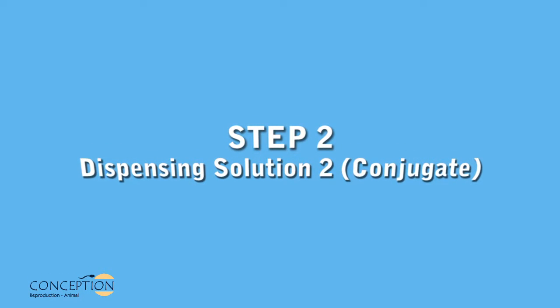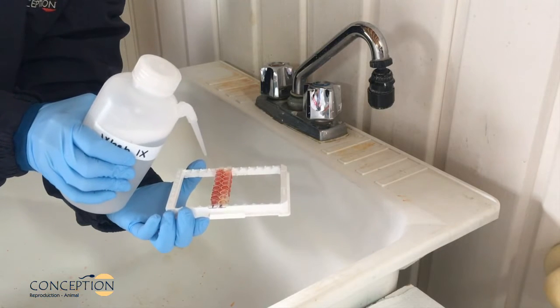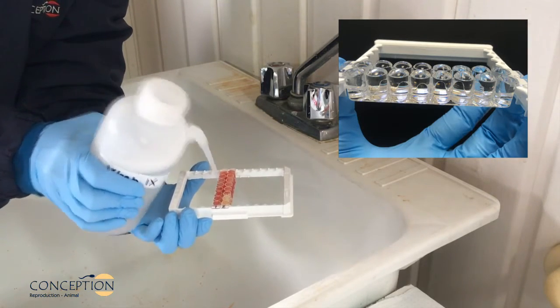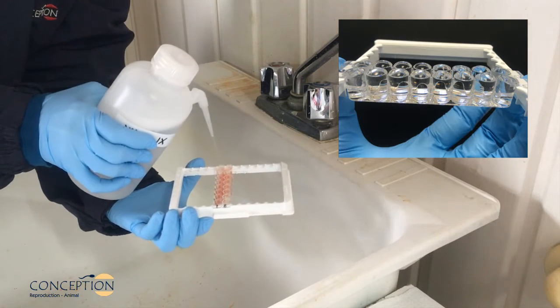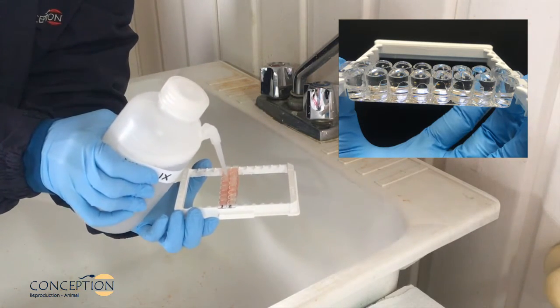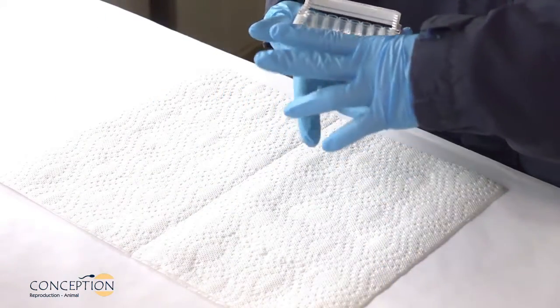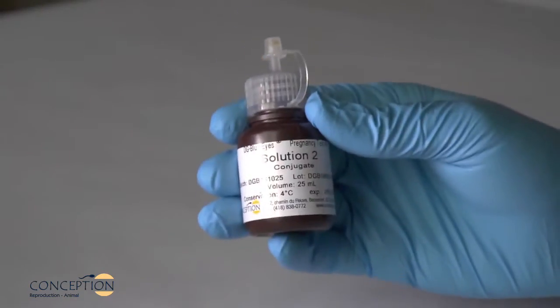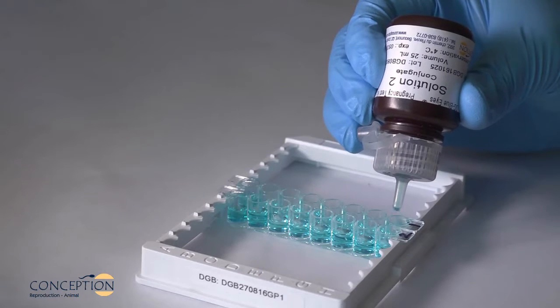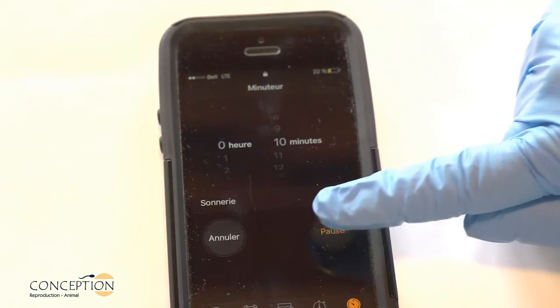Step 2: Dispensing Solution 2, conjugate. Remove the plate cover and empty the plate by inverting and shaking vigorously in a sink. Fill the wells completely with the washing solution and empty the plate by inverting and shaking vigorously in a sink. Repeat 5 times. After the fifth wash, invert the plate and tap vigorously on clean absorbent paper towel to remove residual liquid. Gently shake Solution 2, conjugate, and dispense three drops into each well. Gently shake the plate to mix, cover the plate, and incubate 10 minutes.